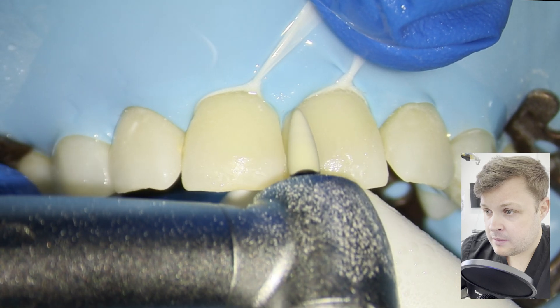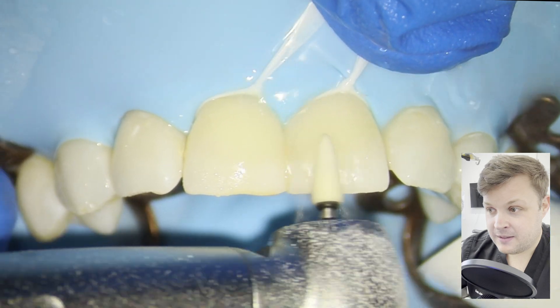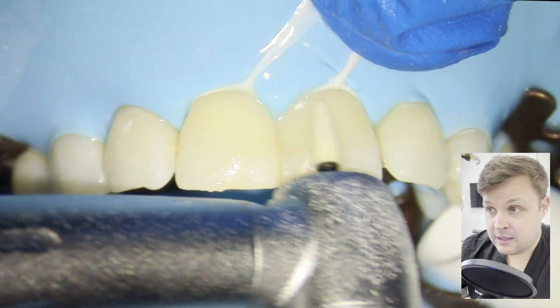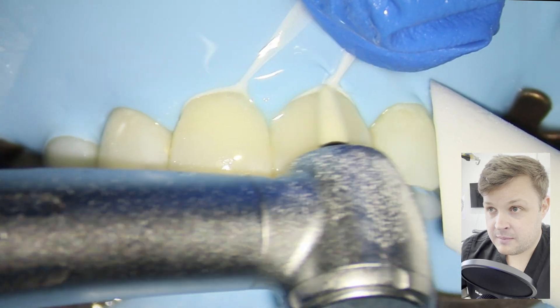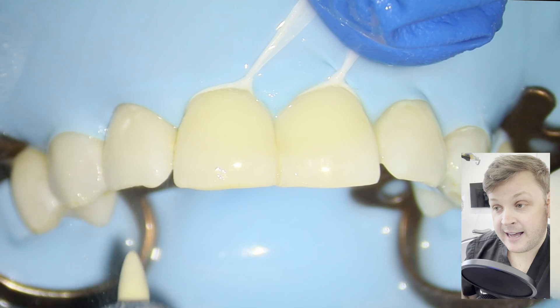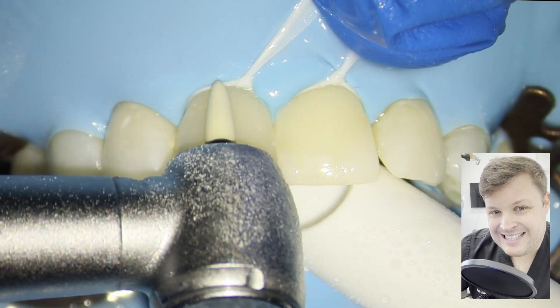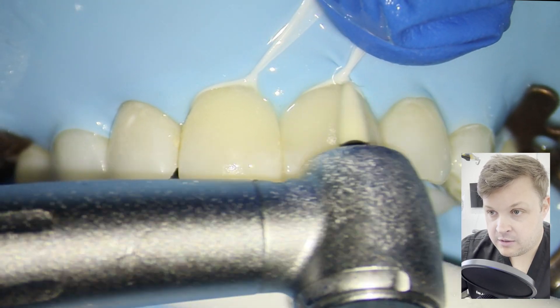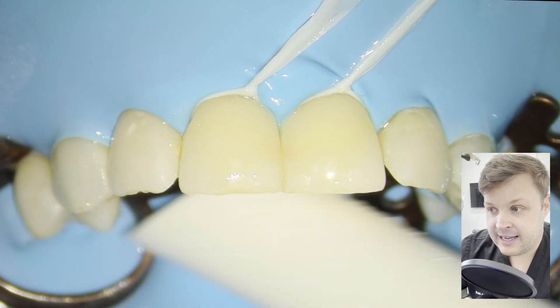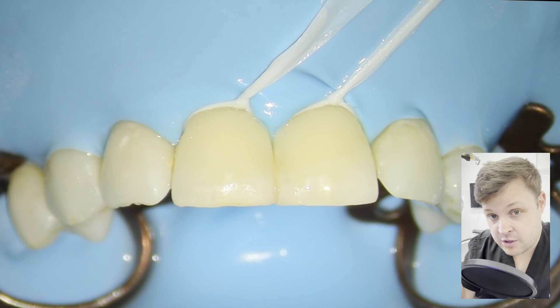Here I'm using my trusty Diora stone. I think these are great. I used to use a diamond torpedo — a red one, not fine grit but smooth grit — which is nice when you want to take a moderate amount away without the micro peaks and troughs of a coarse diamond burr that make polishing harder.